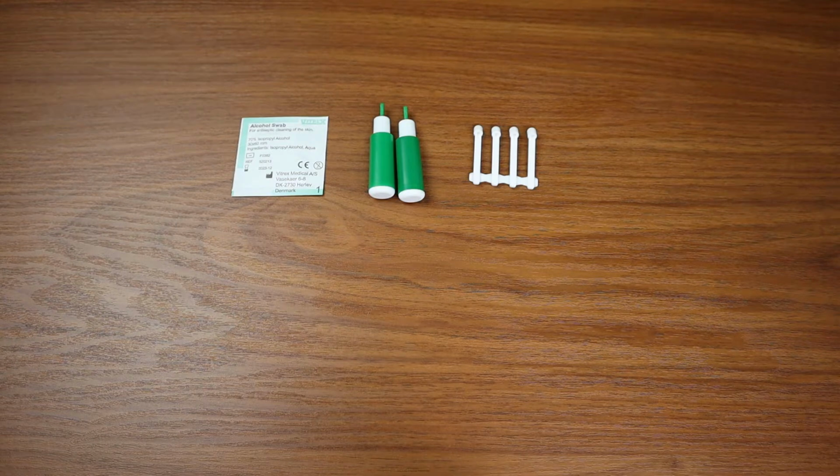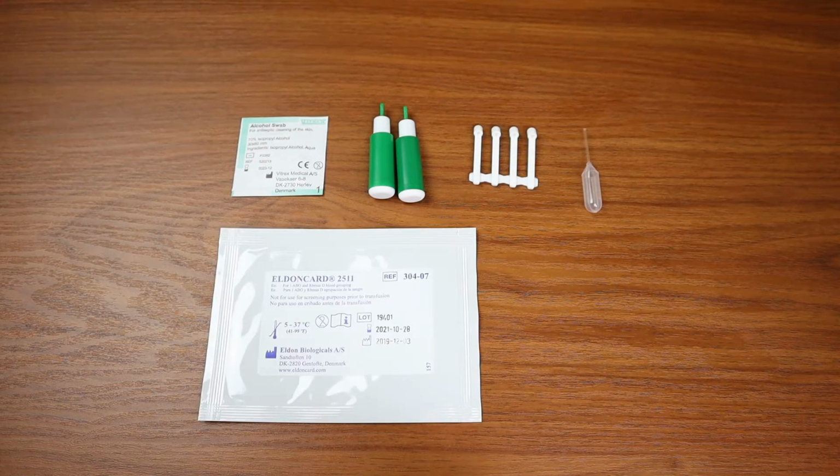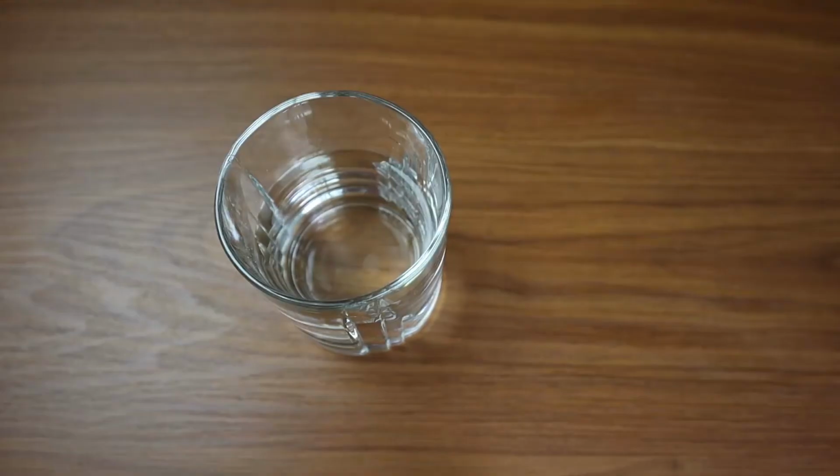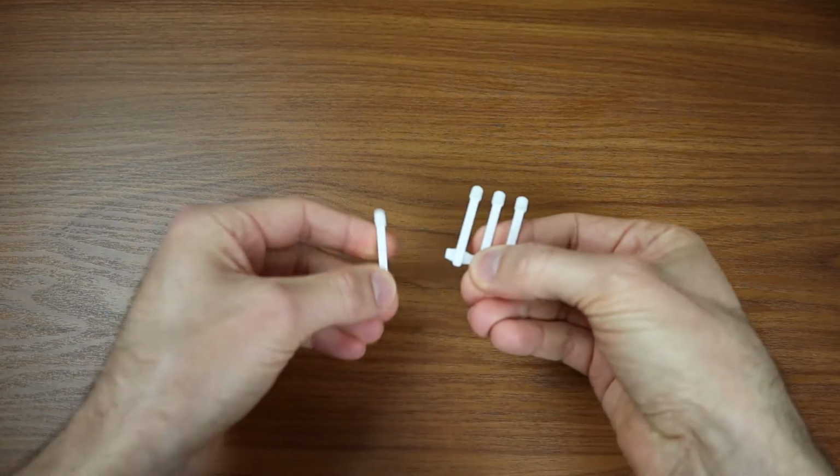A sterile alcohol swab, 2 lancets, 4 Eldon sticks, a pipette, the Eldon card, and the Eldon foil. You will also need a small cup of water. There's a couple of things you need to do to prepare. First, separate the Eldon sticks.